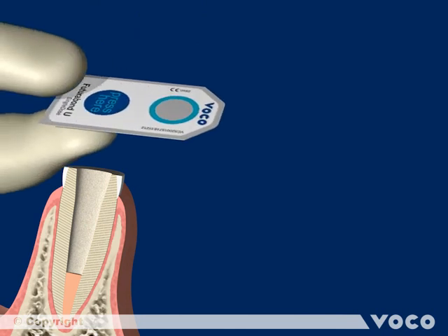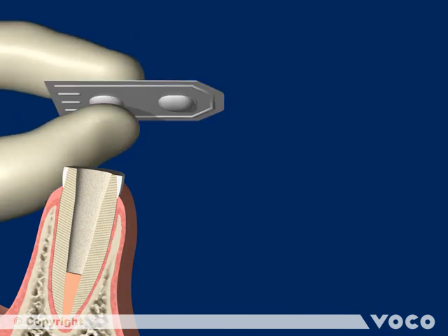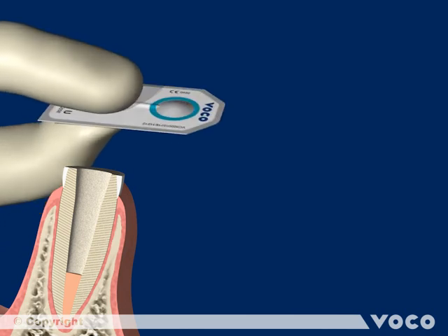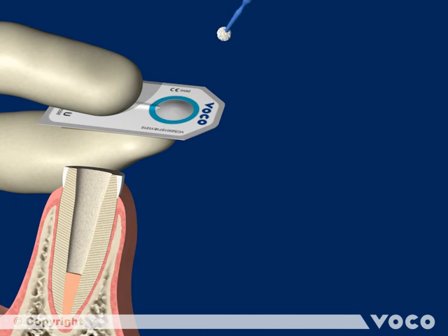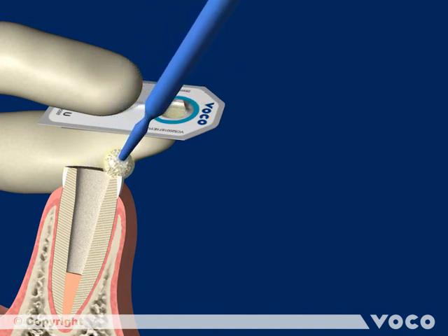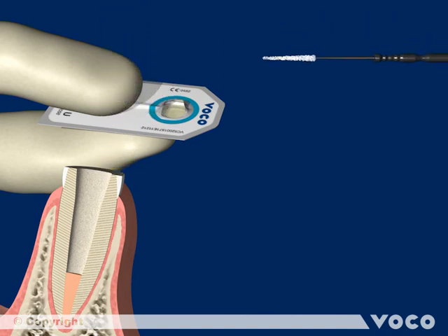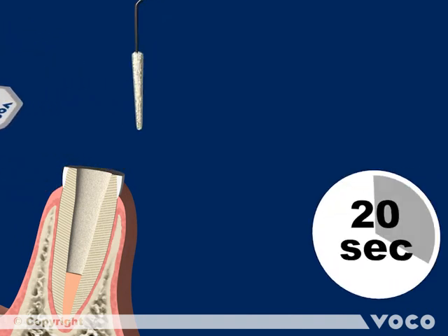Futuro Bond U is a dual curing universal adhesive. Simply activate the single-dose blister by pressing between thumb and forefinger and penetrate the foil to the chamber with the single-use applicator. Give the adhesive a quick mix and apply it onto the tooth and rub it in for a few seconds. Then wet the Endo-Tip applicator with the adhesive and apply it into the root canal and rub it in for 20 seconds.